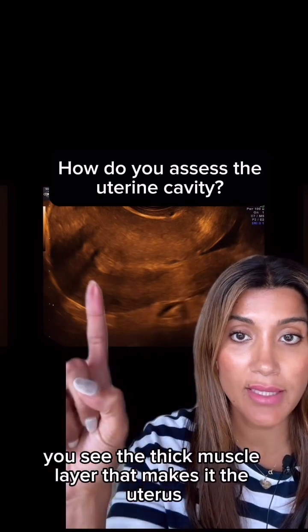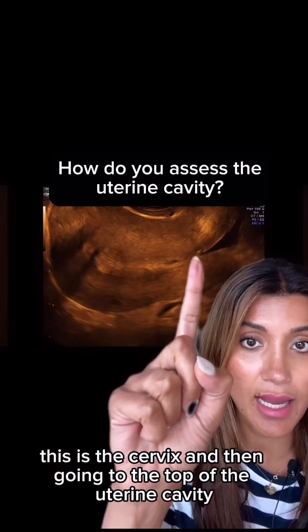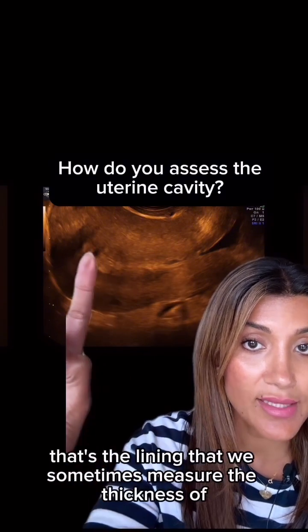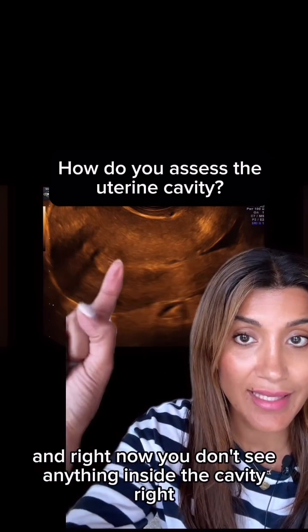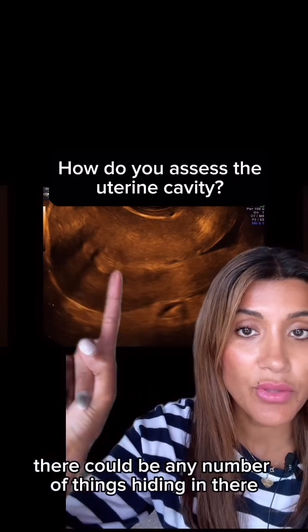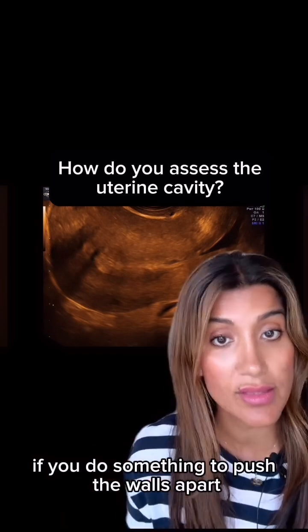You see the thick muscle layer that makes up the uterus, the inner cavity here. This is the cervix. And then going to the top of the uterine cavity, you see this line here. That's the lining that we sometimes measure the thickness of. And right now you don't see anything inside the cavity, right? It's a collapsed space. And so there could be any number of things hiding in there that you're only going to see if you do something to push the walls apart.